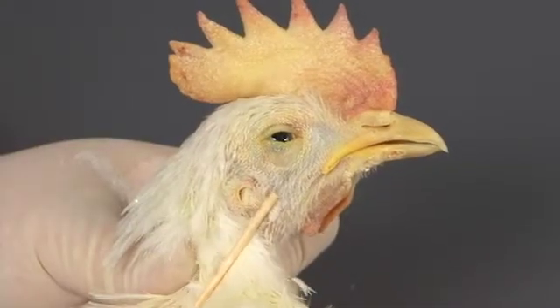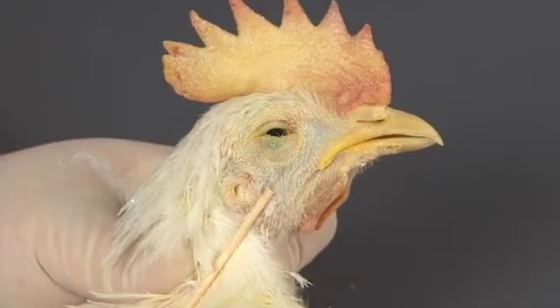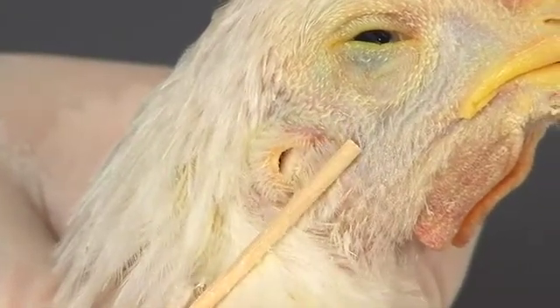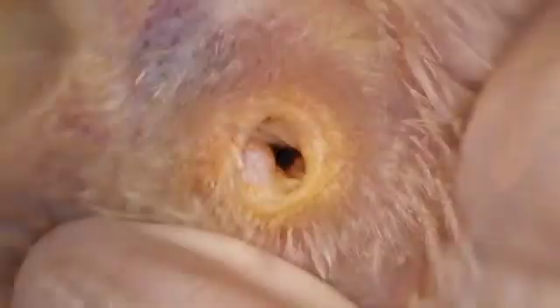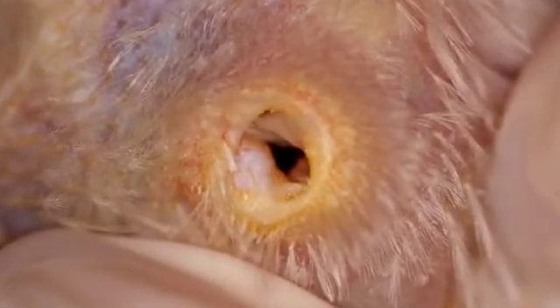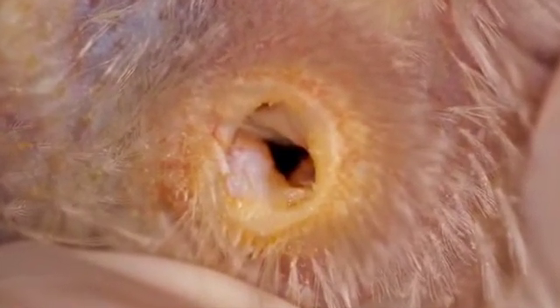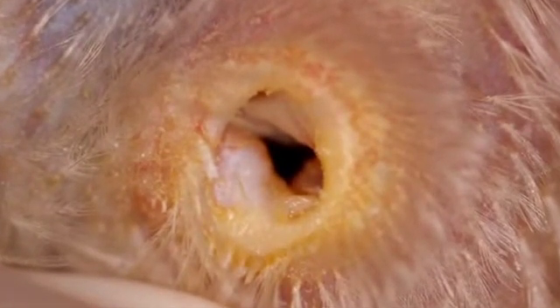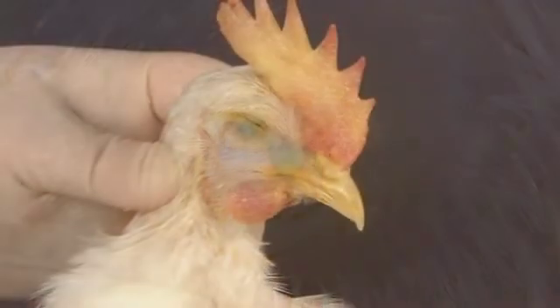Examine the external ears, located caudal ventral to the eyes. The ears are located under short, stiff, covert feathers. The ears are simple round ostia with no external pinna. The openings should be free of swelling, exudate, or other material.